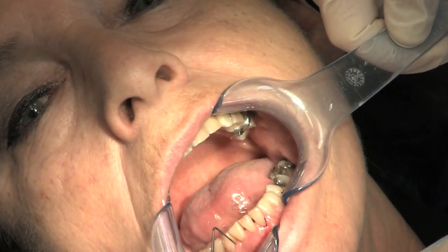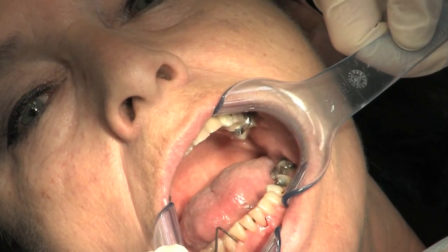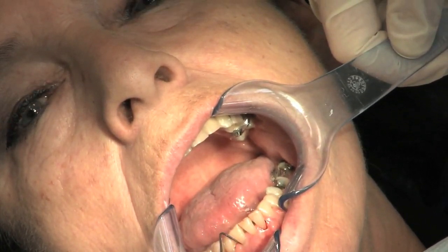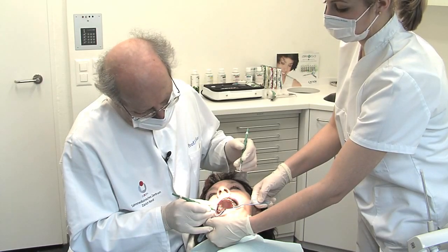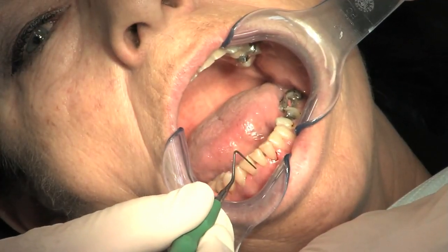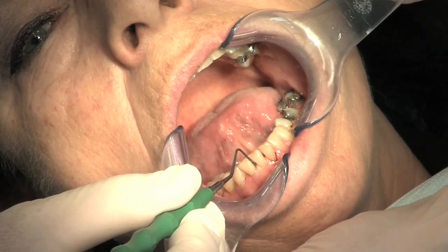When I probe here, for instance on number 4-3, we have here still a pocket of about 3 mm. Here on 2-4-2, I have a pocket of 6 mm. And then buccally it's okay. Also here mesially it's okay — we have about 4 mm.